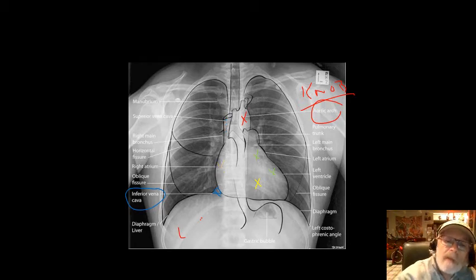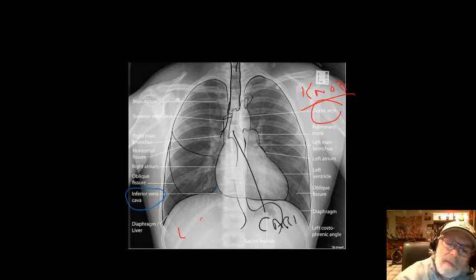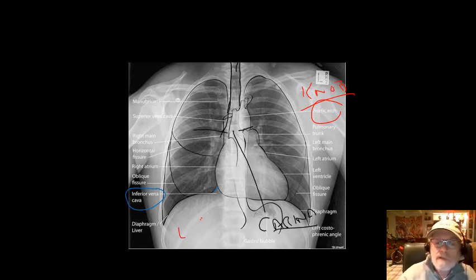Let me get rid of all these things again, and we'll follow what we can actually see here. Outline right there, you can see how it's darker in that area, and that area would be the trachea. And you actually see where right here it starts to bifurcate. So this area right here would be the carina that we talked about in class. That's where it divides, going to my left main stem bronchus and right main stem bronchus right there. So it's actually a pretty nice picture.